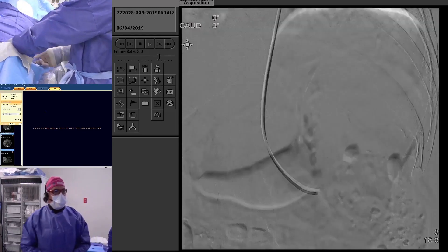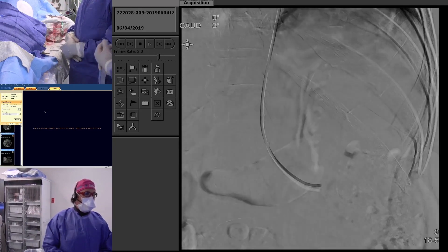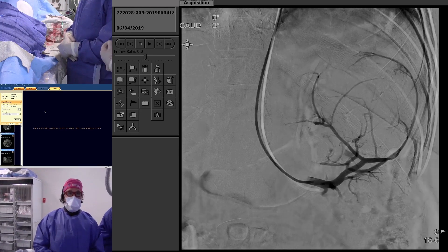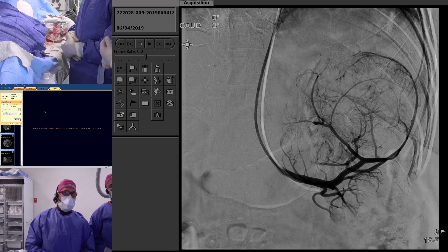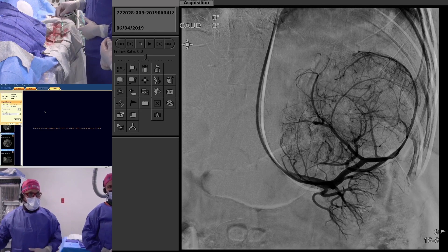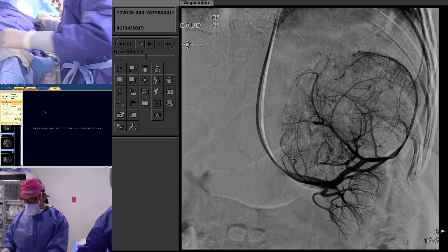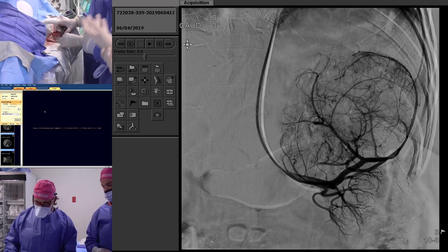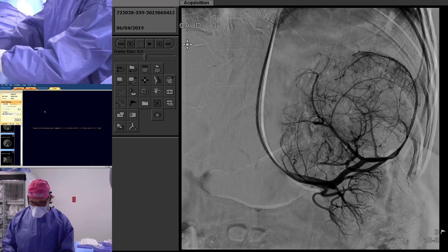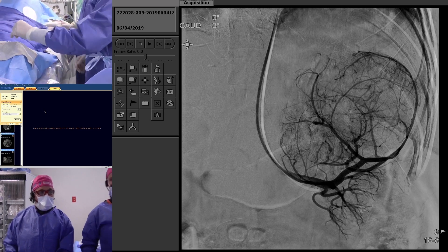I had a long conversation with her urologist, and he has no desire to operate on her at all given her CKD. The plan — and I actually haven't embolized an oncocytoma before — is to try to decrease the potential bleeding risk and maybe decrease the tumor size if she is a candidate for surgical resection in the future, which will make it easier. I have a Sniper catheter here. My plan was initially to use Onyx, because I don't want her to have too much pain after. We had a long conversation about what to expect after embolization of a mass this big, and she had a lot of concerns about pain, so I thought Onyx would be a reasonable option.